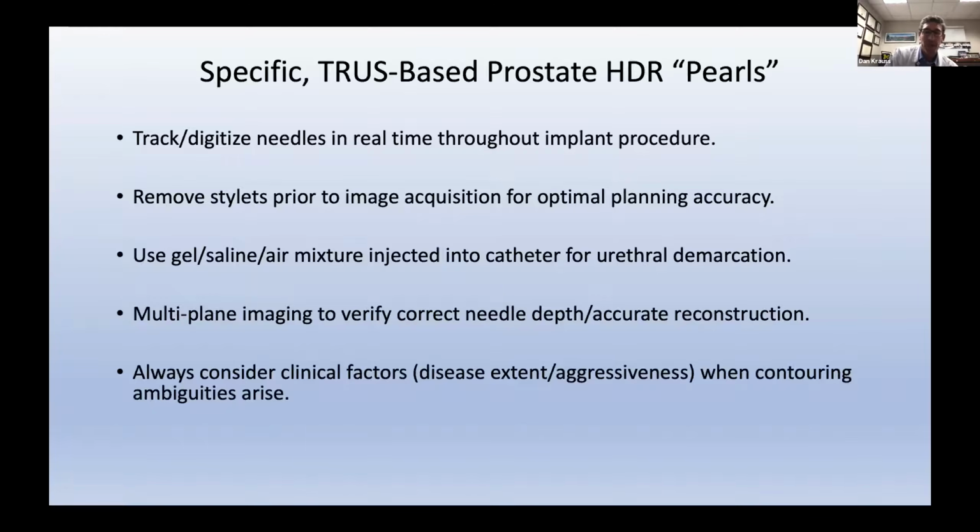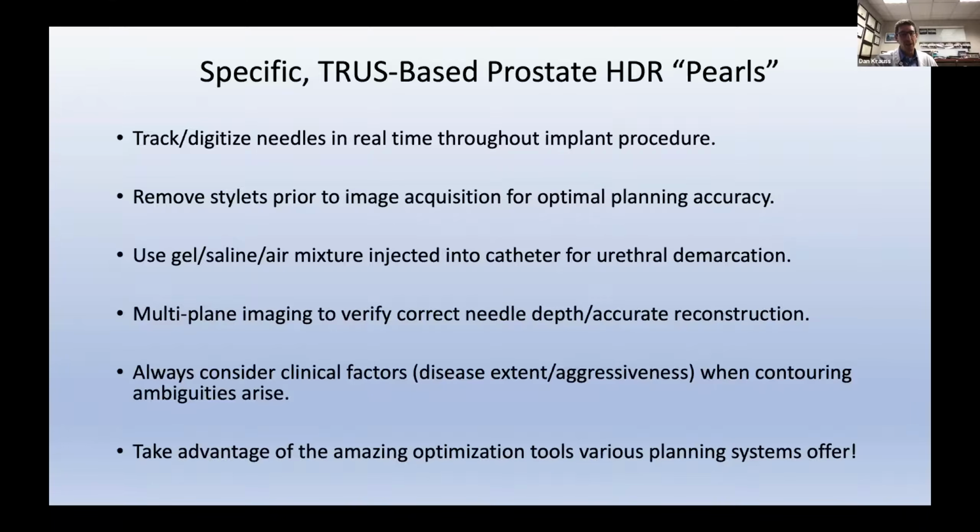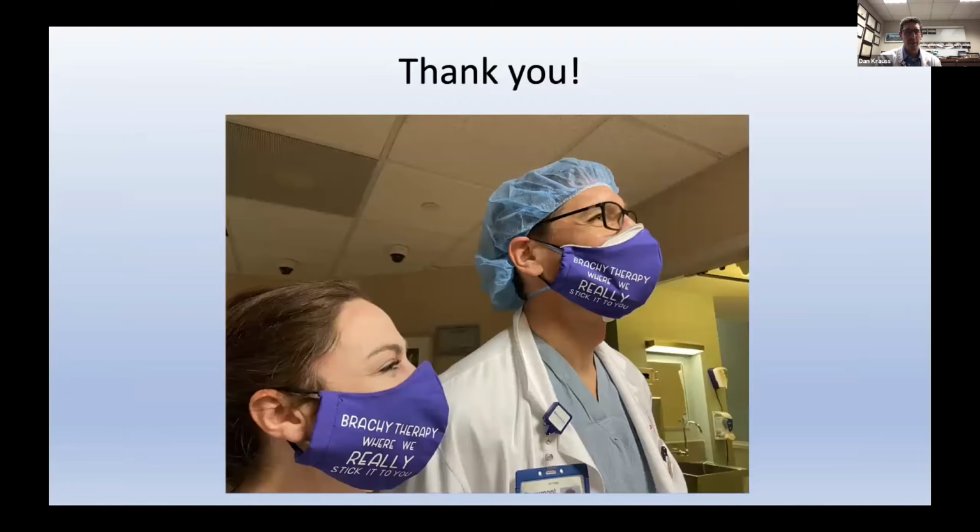Always consider the clinical factors such as disease extent and aggressiveness when contouring ambiguities arise, and take advantage of the amazing optimization tools that the planning systems offer. So that's it. I'm done.